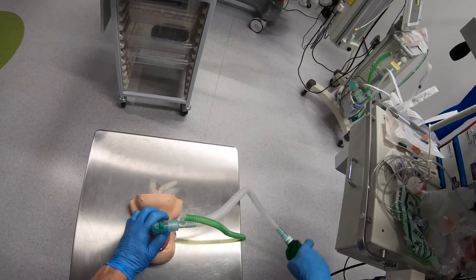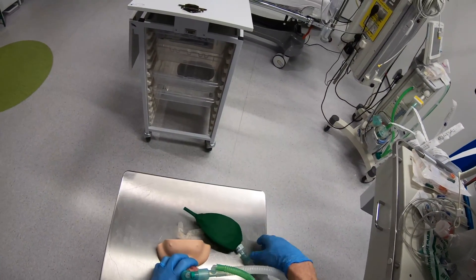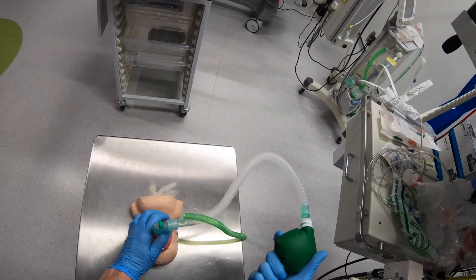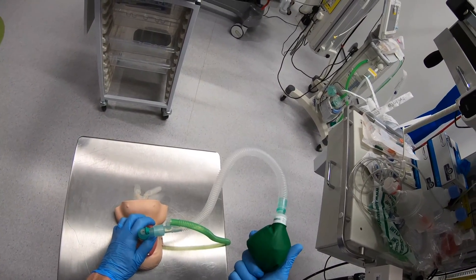So I can use this circuit as a device to give oxygen to the patient, I can occlude the end and let the patient spontaneously ventilate and just give them PEEP, or I can give positive pressure ventilation with PEEP.